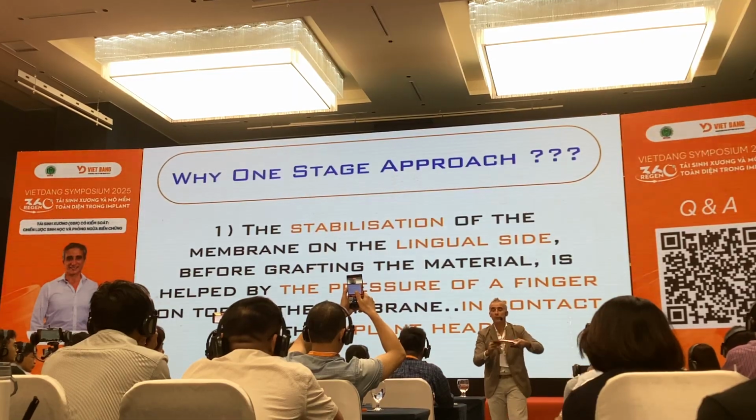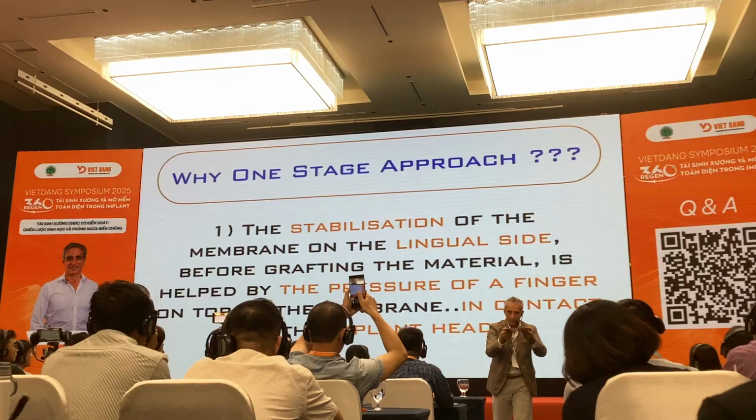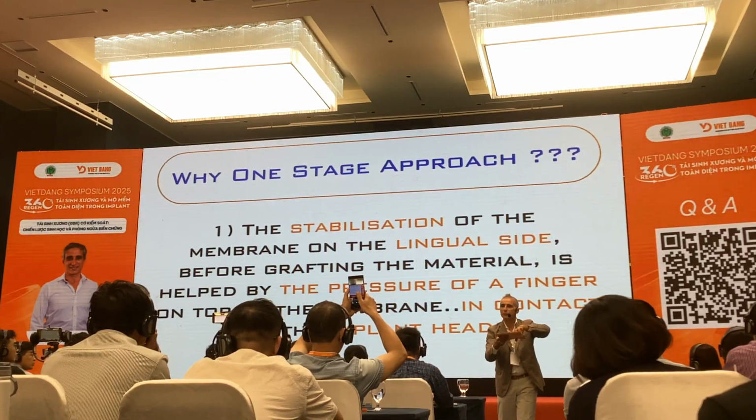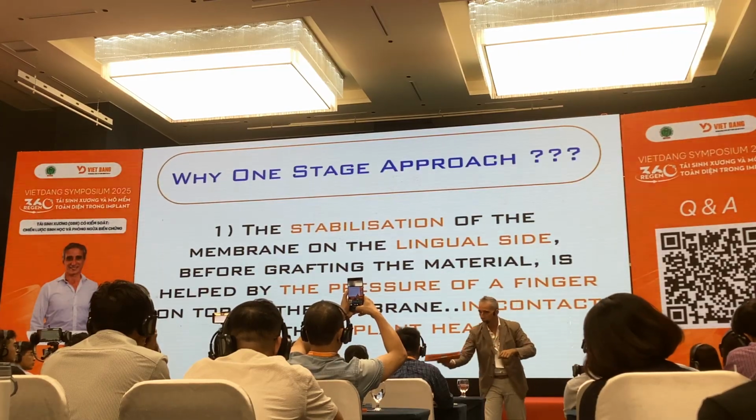It's very difficult to maintain the stability of the membrane without any risk of modifying the shape of the defect.